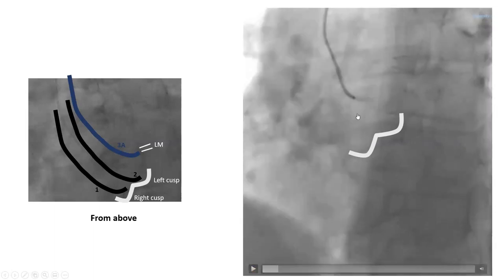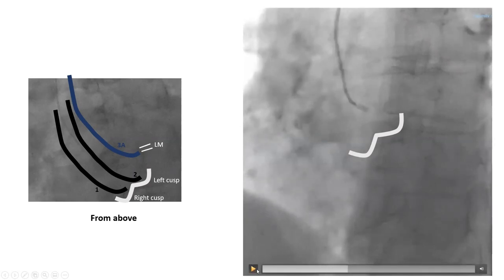You can keep counter-clocking hoping it will engage with that opposite maneuver, or like we did here, you push it and try to engage from below. This is a moment most fellows miss — they don't react quickly enough. As you're starting to torque, the catheter is going away from you, and they wait until it's already flown out before reacting and trying to reverse — by that point it may be too late. You may need a wire and may need to restart. It's key to react to that one single most important moment in radial: immediately reverse your torque and either engage from above with the opposite torque or go back down to the valve and engage from below.